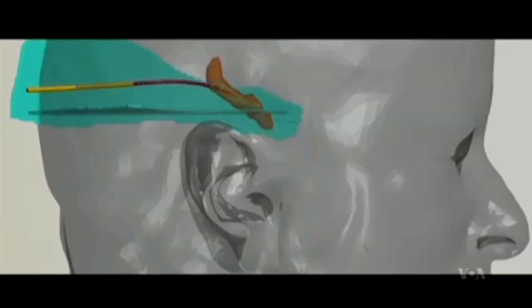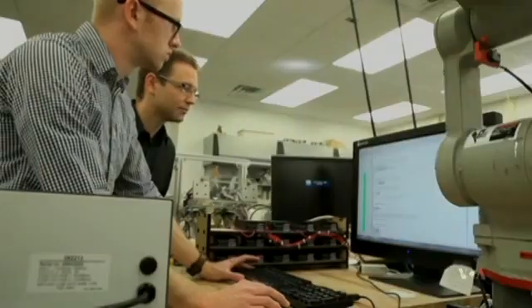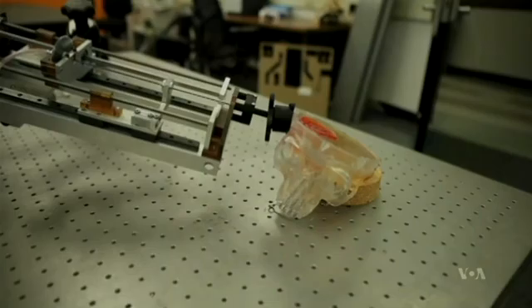The tubes will navigate around delicate brain matter, not through it. The researchers are trying to design tools that could attach to the robot, such as a tiny grasper that could break up a clot before suctioning it out.